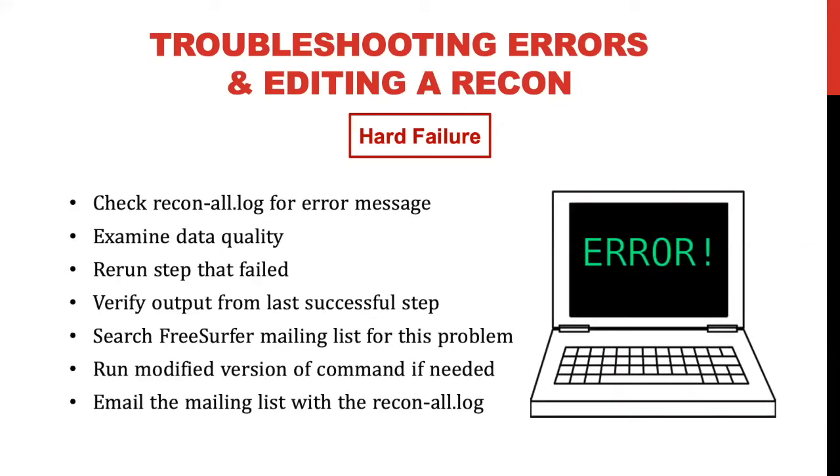So what to do if you come across a hard failure? As I said, check your reconall.log error message, then go through your data and assess how your sample is, if there's good contrast. You could also rerun the step that failed, verify the output from the last successful step, and perhaps a common step that some of our users do is search the error type in our mailing list. If you search for the keyword recon all with error, you will probably see a response from a previous lab member that tackled this question and helped another user solve it.